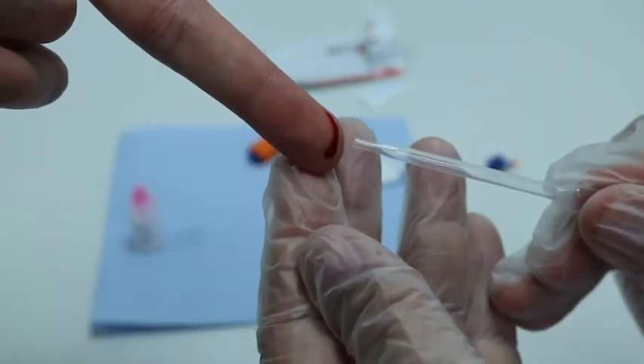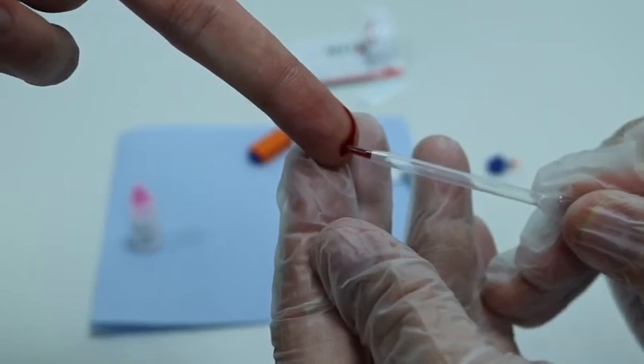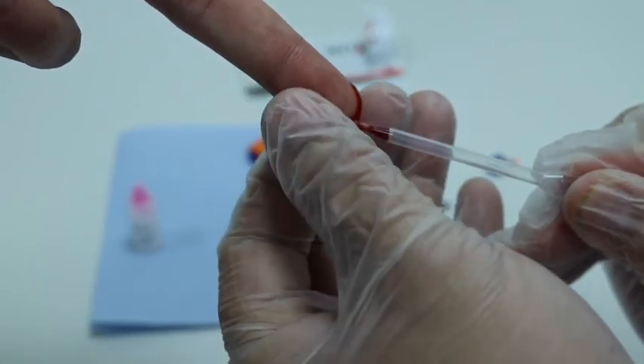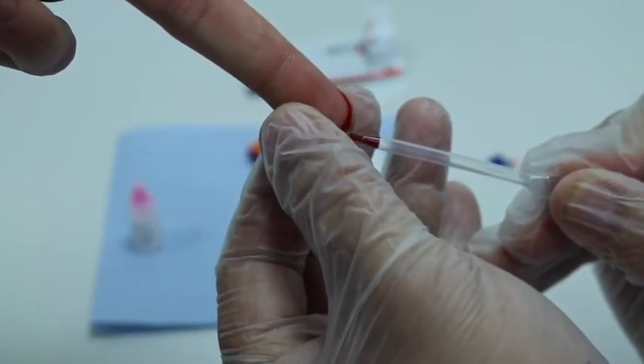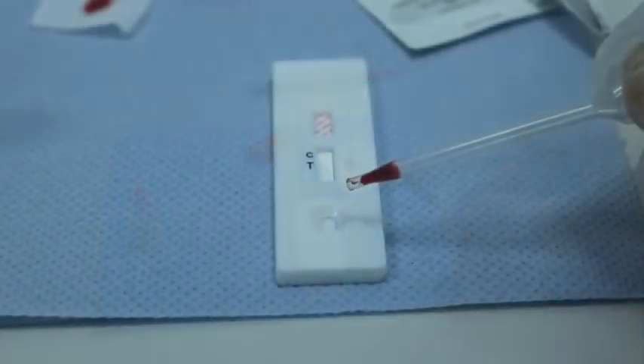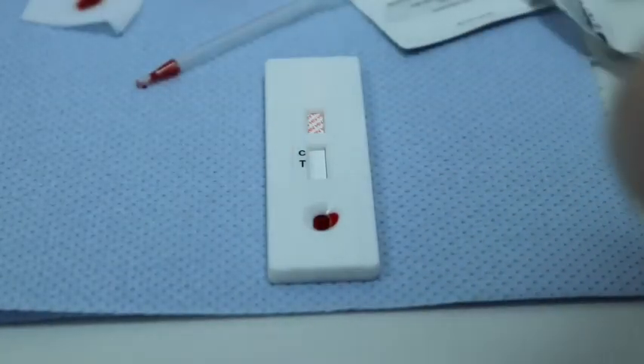Wait for the drop of blood to reach a size where it is close to falling naturally. To collect the sample, gently squeeze the bulb and suck the blood into the pipette. Do not attempt to suck all of the blood as this will create air bubbles that may interfere with dispensing. Dispense one drop of blood into the sample S-well and make sure the drop of blood falls naturally and without air bubbles.